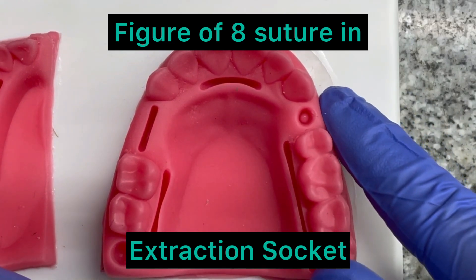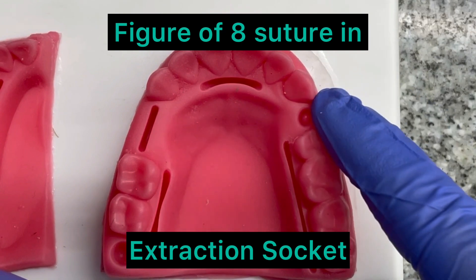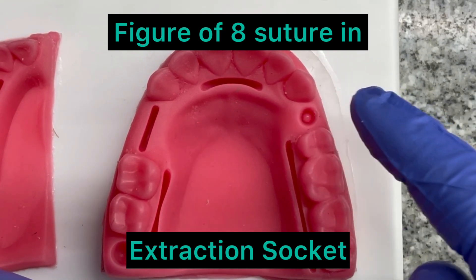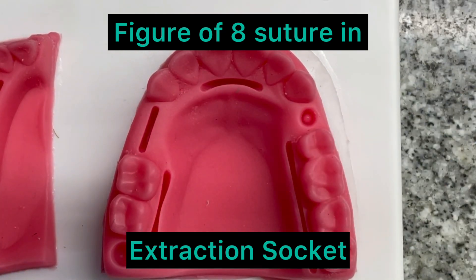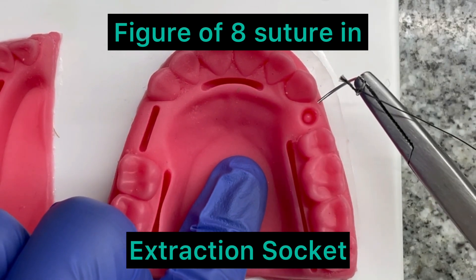Let's learn about suturing in the extraction socket. The figure of eight is the suture most commonly given in the extraction socket. I am going to give a little demo on how to give a figure of eight suture.